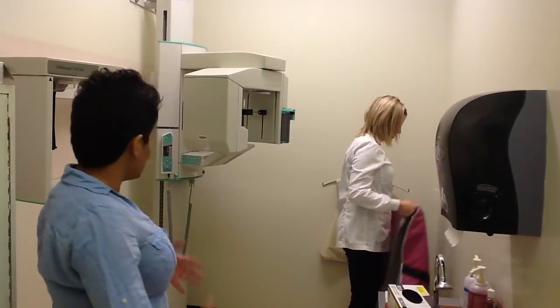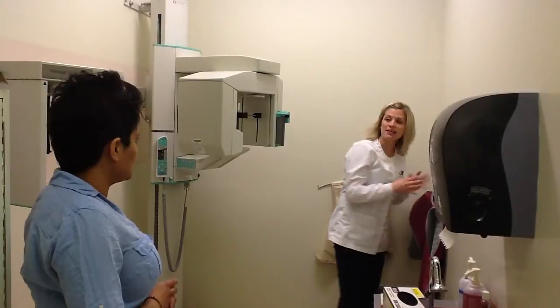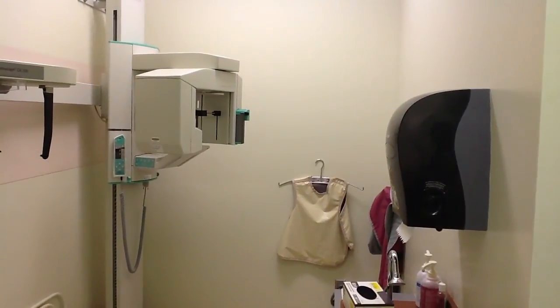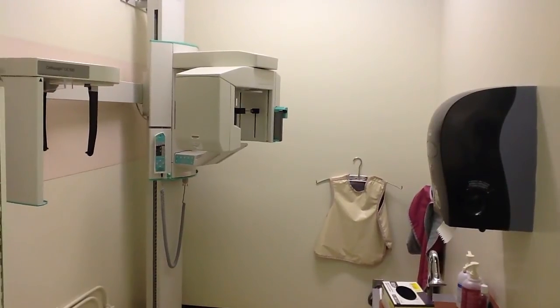No. Do I see the image produced right away? I have to process it, so it'll take about 10 minutes, okay? So I'm going to walk you back to your operatory. Sure thing. And then if you need a magazine or a drink of water, let me know, and I'll be back in about 10 minutes, okay? Sounds good. Okay, thanks very much. Thank you.